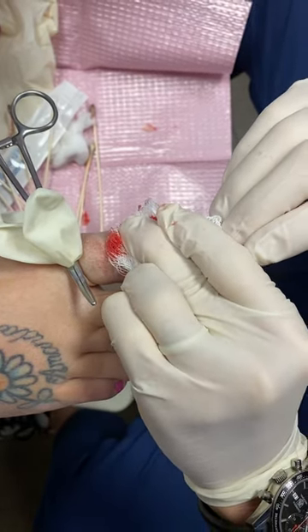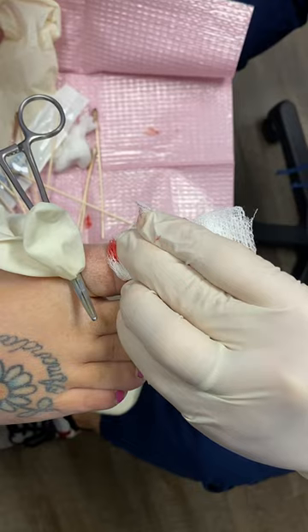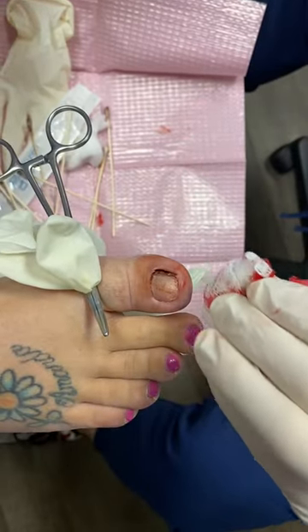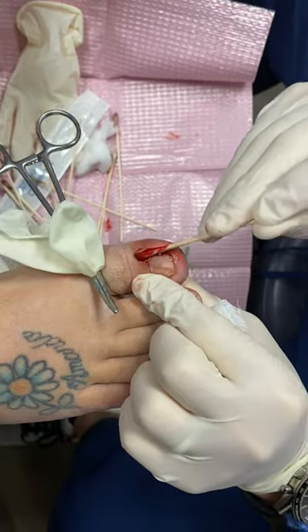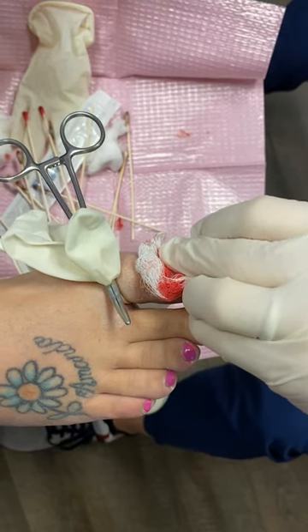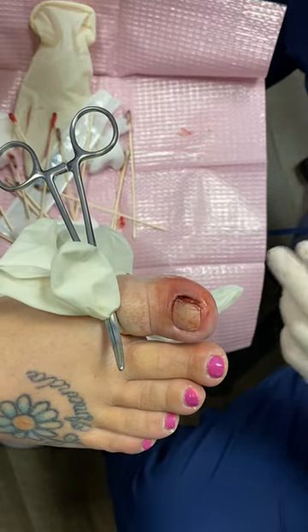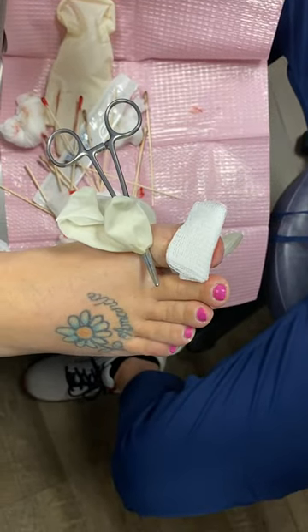So we put four applications of phenol in there, and then we're going to take a Q-tip and flush this out with a little isopropyl alcohol. She's going to go home today, numb for hopefully about four to six hours. She's going to take a little Tylenol. Her toe might feel a little heartbeat in it once the numbing medicine wears off, and she'll take the dressing off when instructed. I'm going to put a little hydrogel in here to help wick everything out, and she'll do some dressing changes at home.